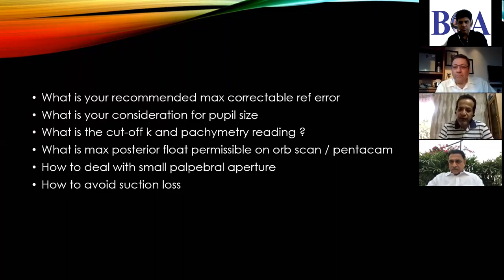This is even if you don't do a pupillometry, though I'm not recommending that you shouldn't do a pupillometry. Pupillometry has its definite importance, but a general rule to follow is that if a contact lens user was glare free while night driving, he usually should be a good candidate for a LASIK with a 6.5 millimeter optical zone. That's a lovely point, Nitin. Very good point. So next question.